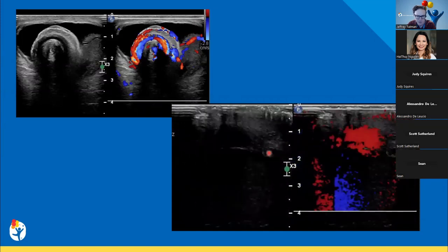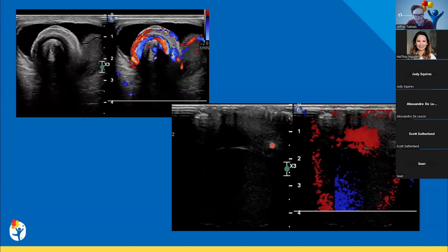This particular patient was treated conservatively, which surprised me a little bit, but this triggered a lot of conversations with our urologist, and I definitely learned a lot about this particular diagnosis of what they would call either an intermittent or partial torsion. To make the diagnosis of intermittent torsion, at least where I am, the urologists have asked us not to use that specific term in our reports.